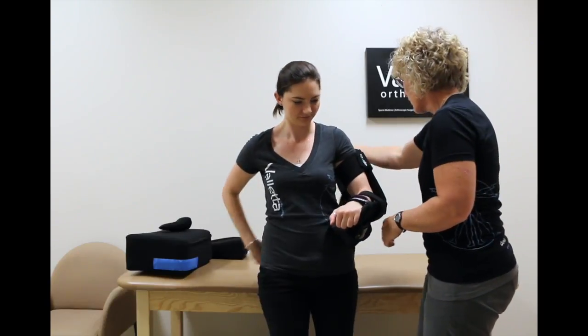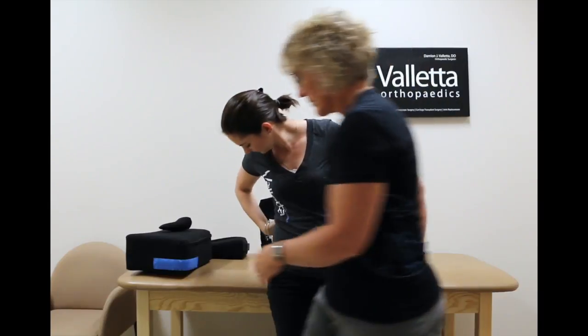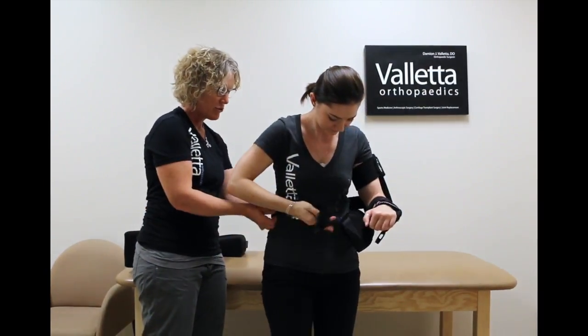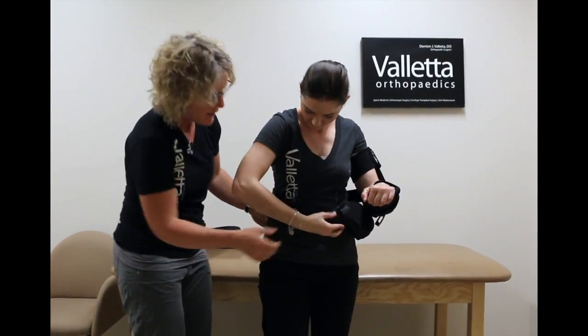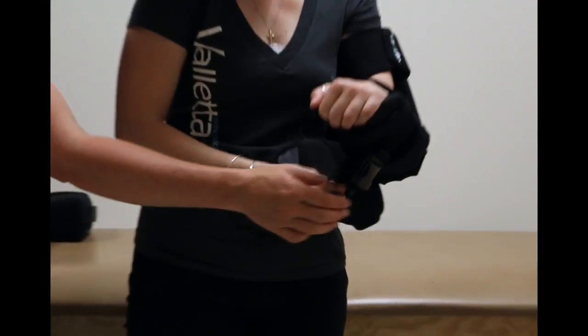Coming from the back, the black strap comes around the side. The black strap should be on the side — it goes through the little loop and buckles.